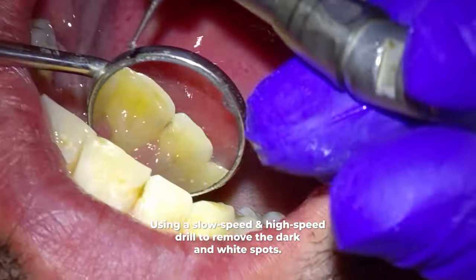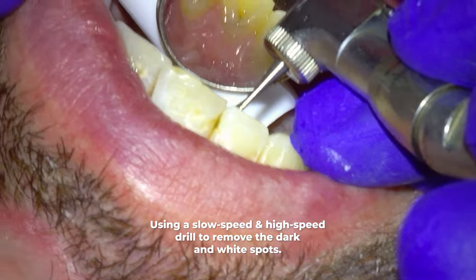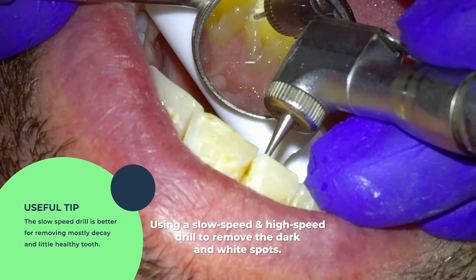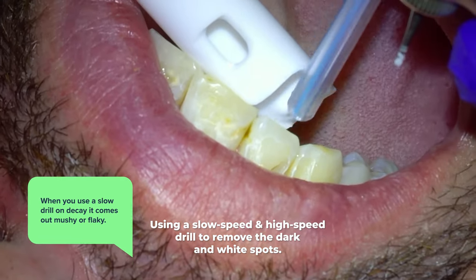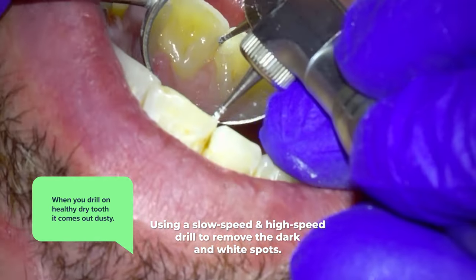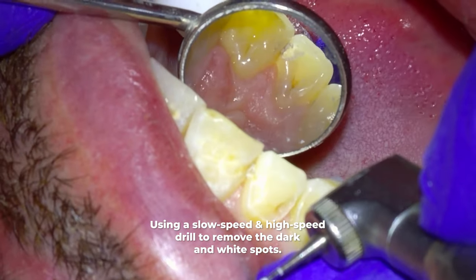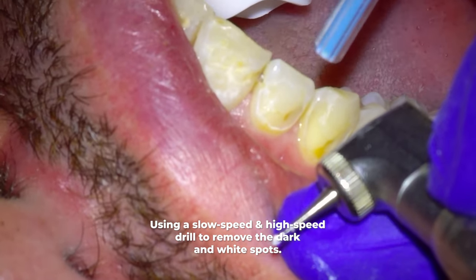We've done all of this until this point with my high speed drill. But now we switch to a slow speed drill. The high speed drill is better for removing healthy tooth, and the slow speed drill is better for removing mostly decay and very little healthy tooth. When you use a slow drill on decay it comes out as a mushy or flaky substance, whereas on healthy dry tooth it comes out as a dusty substance. This is important because you know when you've removed all the decay with the slow speed drill because it's no longer mushy, and you know you don't need to drill further once you're getting into dust.